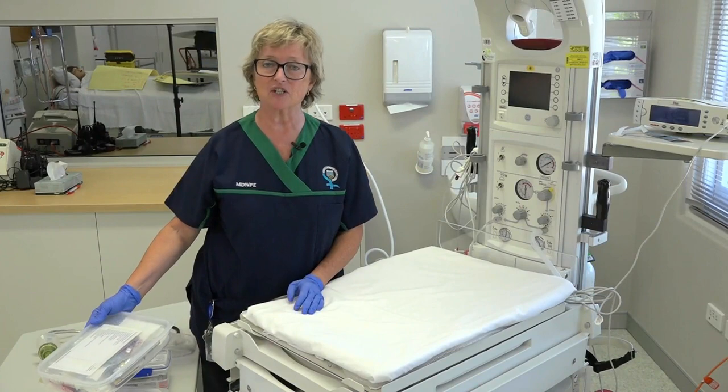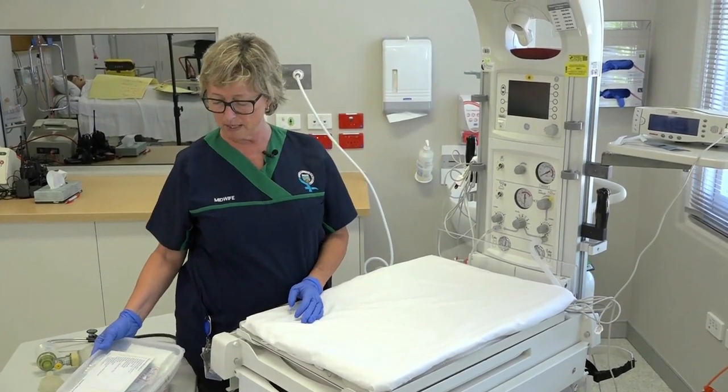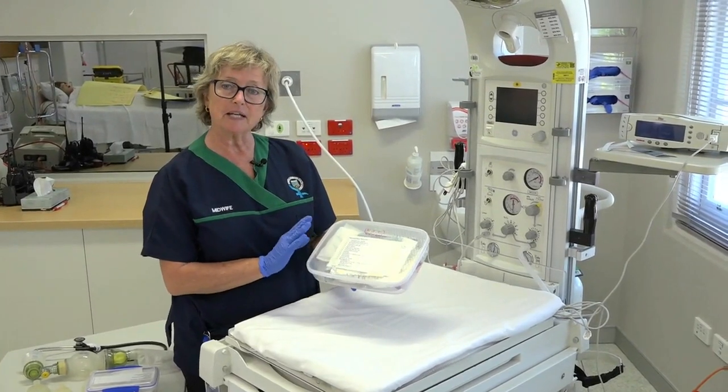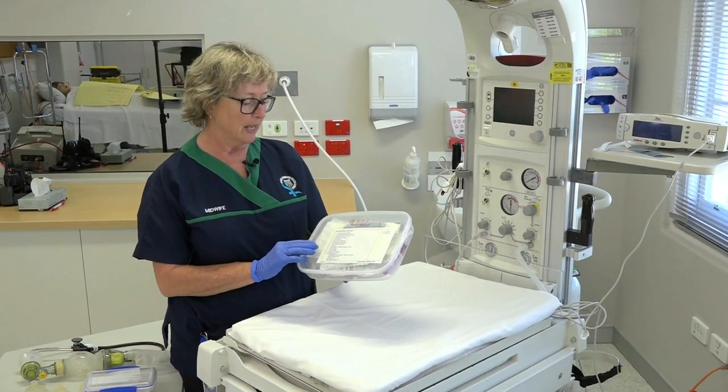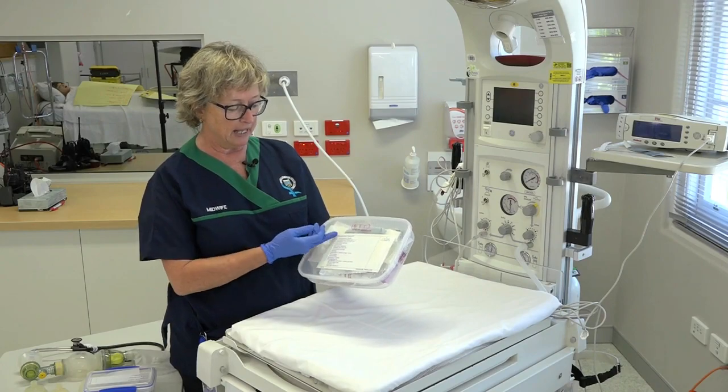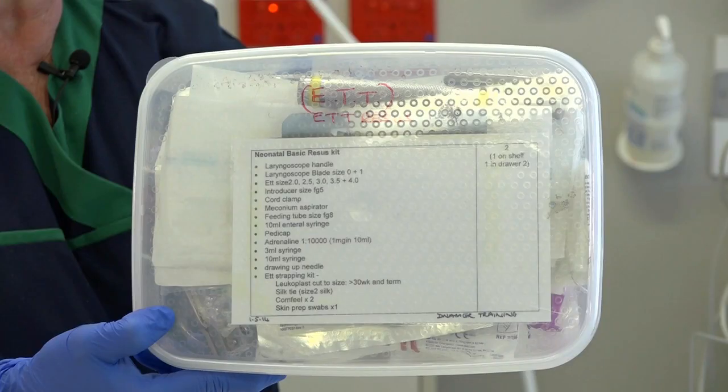We'll have a look at some of the additional equipment that you'll need for your resuscitation. We have purpose-built kits for endotracheal resuscitation if required, and they should have on the front a list of what's in the kit. They should be sealed and dated, ready for use, so that you know that they are clean and ready to go.